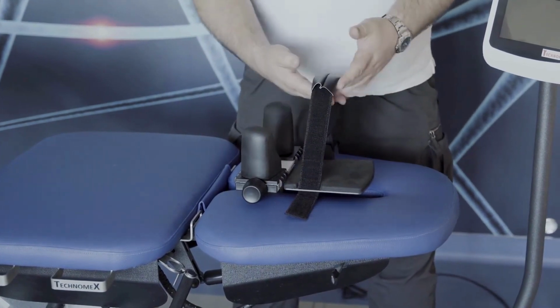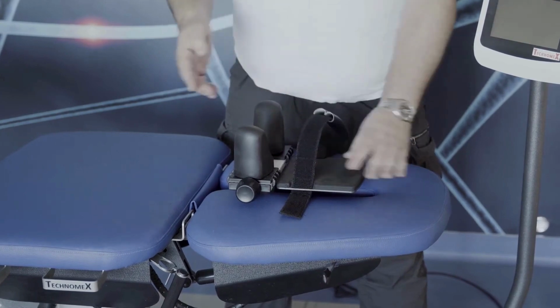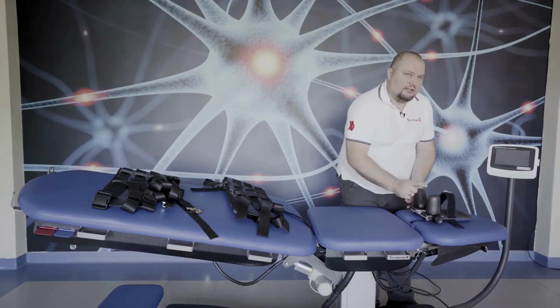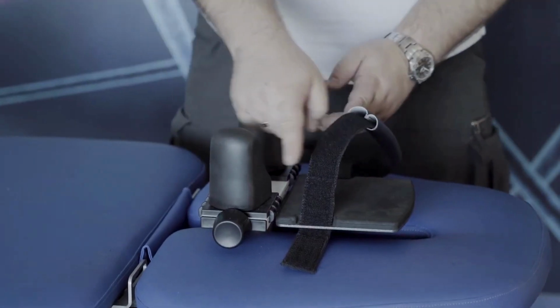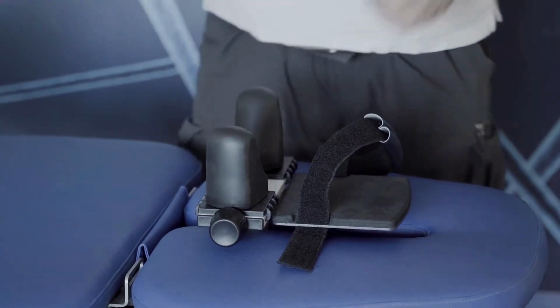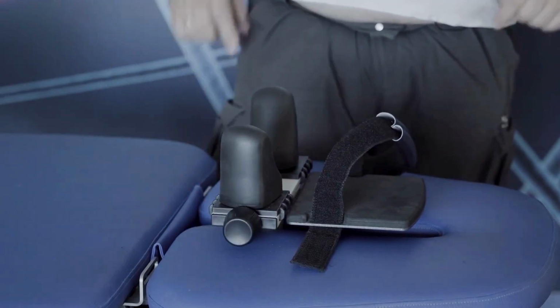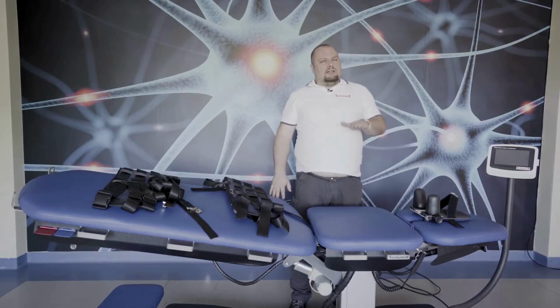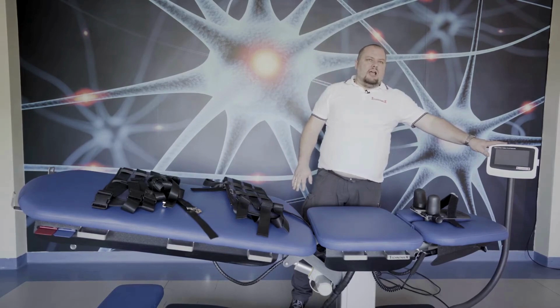Velcro strips to set the patient's head in position on the attachment. And regulation of the width of the neck. The head should be like here, and depending on the patient's neck, how wide it is, we may regulate this to have a firm grip over the head. The regulation of the whole table up and down is from the therapeutic panel, and we will discuss it a little later.